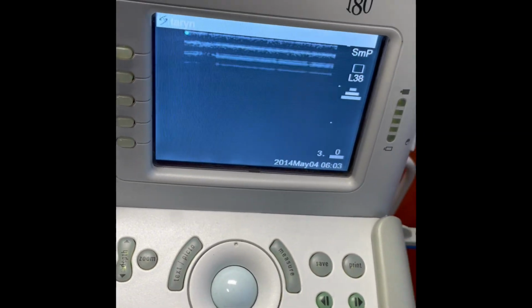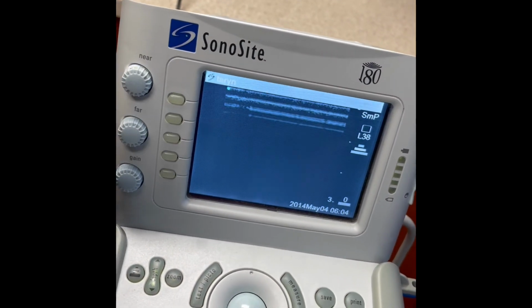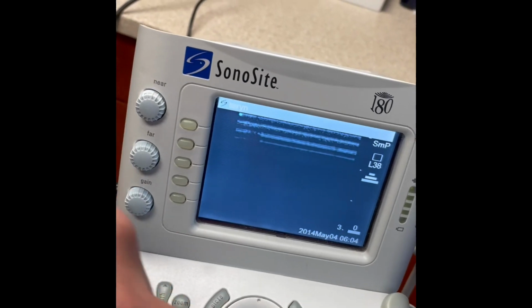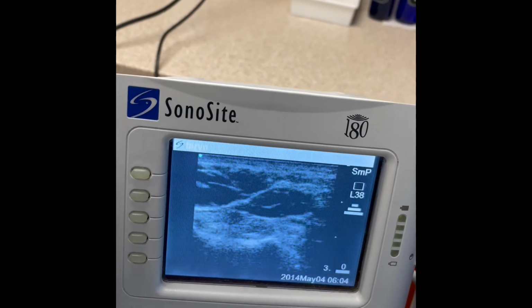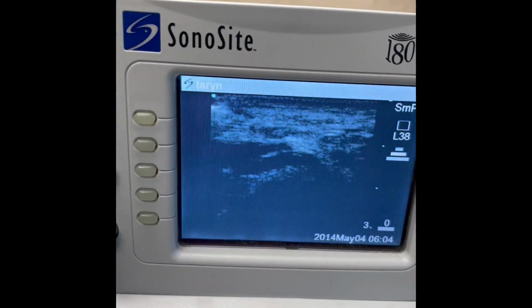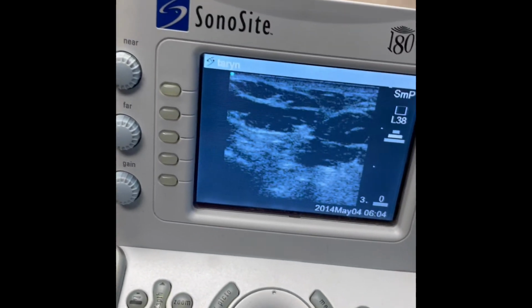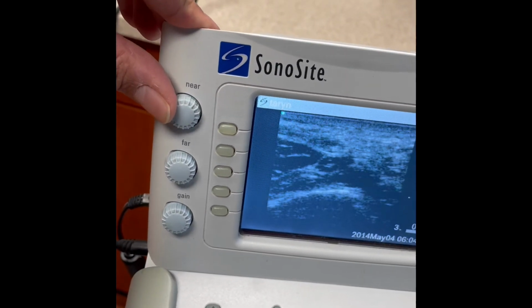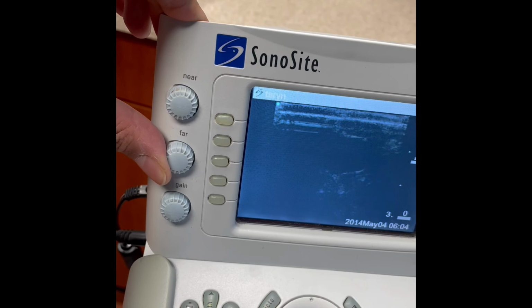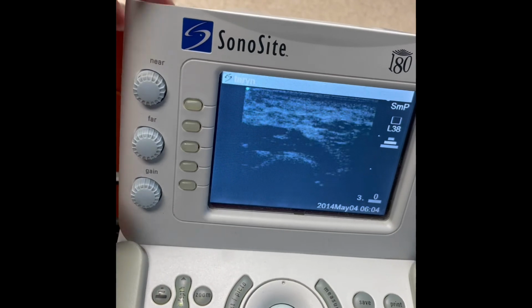Okay. Typically, what we're doing now is, since we cannot print, we're actually taking an Athena capture of the screen image under the freeze frame and uploading it to the Athena capture. Right now, we're only able to take still images of this. Okay, so as you can see, she's working on that. She's moving along. Shows up here, and kind of clear images again. Okay, so if you want, changing this up a little bit helps us focus more for the different anatomical structures.